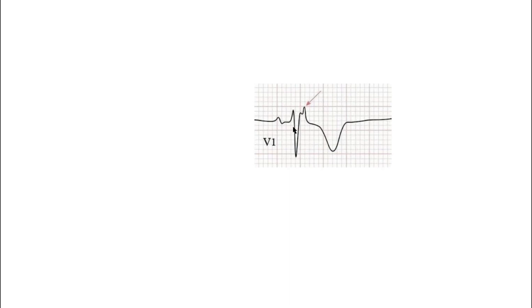Here is a magnified view of an epsilon wave in lead V1. You can see that there is a prominent hump after the QRS complex in lead V1. As mentioned, this is the most specific sign of ARVC on an ECG.